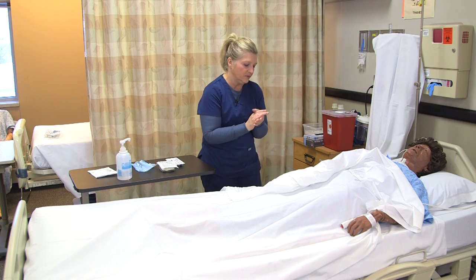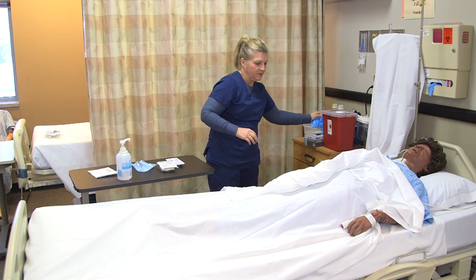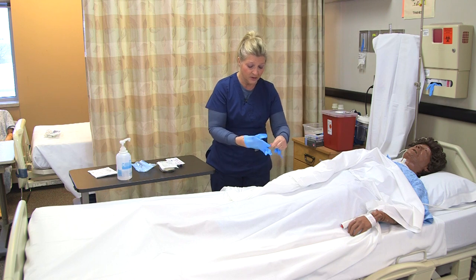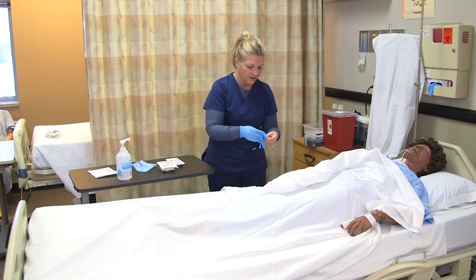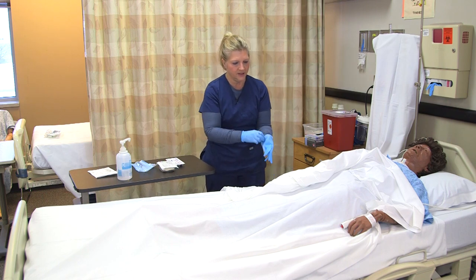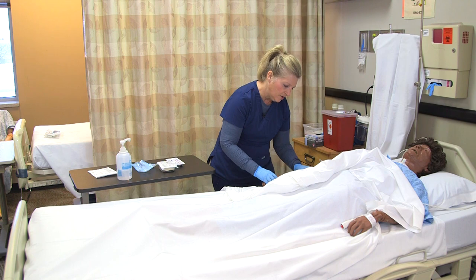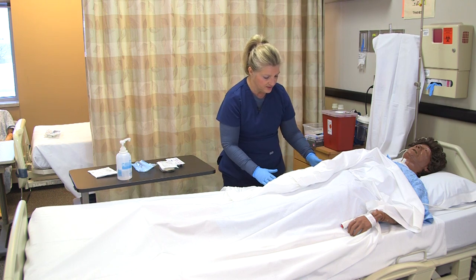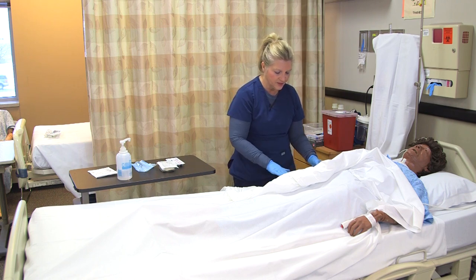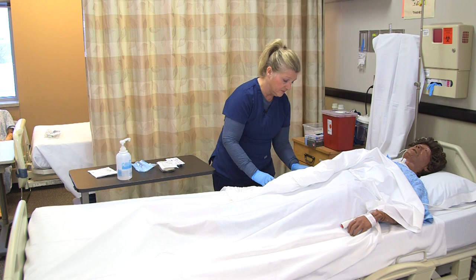When performing IV starts, it's best to find a good vein to reduce pain for the patient and help the vein last longer, especially when giving medications. I go ahead and place my gloves on. I brought all my supplies into the room and checked expiration dates — everything is good. This patient has darker skin, so bright or fluorescent light is best for visualizing veins.